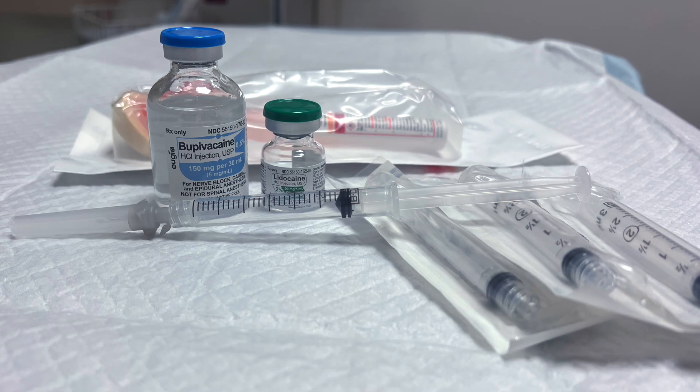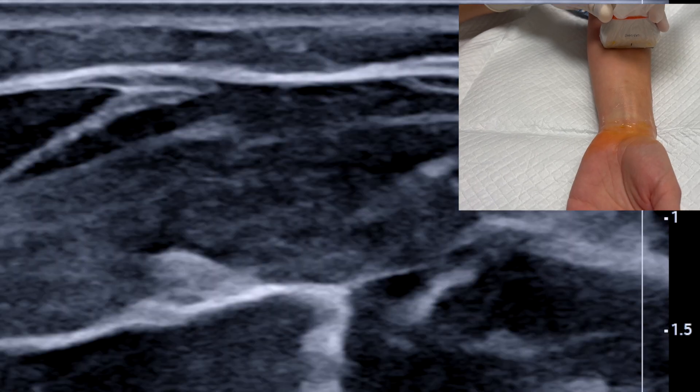You'll need four three-mil syringes with your local anesthetic of choice. Depending on desired duration, we usually use two percent lidocaine or half percent bupivacaine. A 25 or 27 gauge needle is used to reduce tissue trauma.